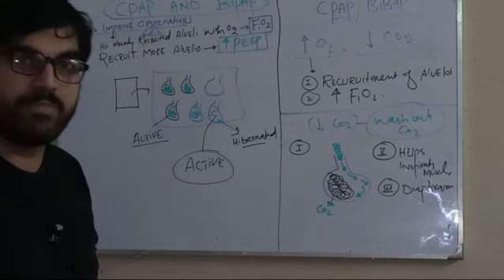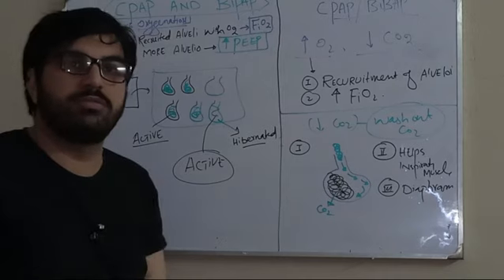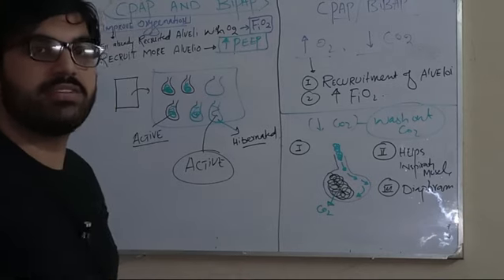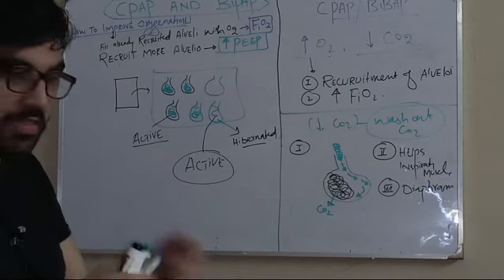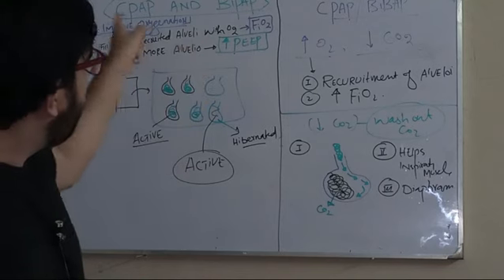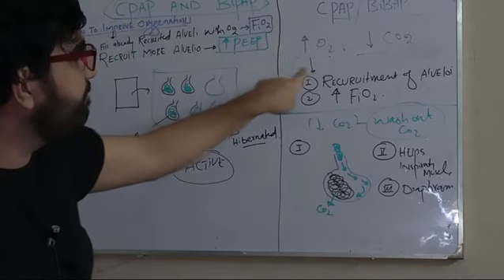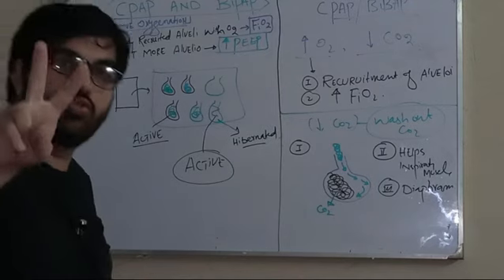Or we can say the amount of oxygen that we give with the high flow nasal cannula, we cannot deliver in our ER and in our setup. Now we have high flow nasal cannulas. So after the non-rebreather mask, the next step is to apply the BiPAP and CPAP. How do the BiPAP and CPAP help? They improve oxygenation and they wash out the CO2. So it is helpful in two things.